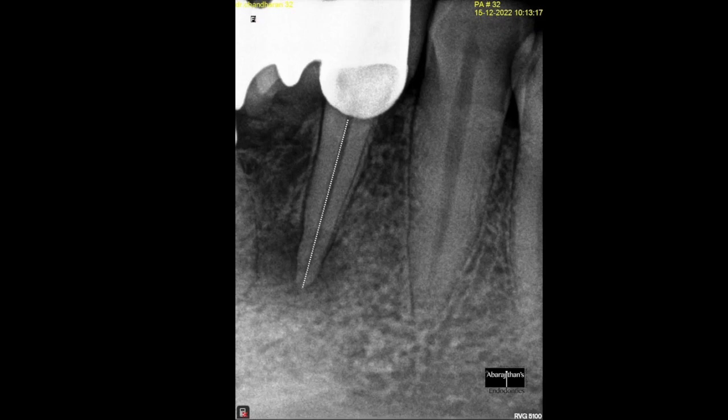These are the details that I could infer from my pre-op radiograph. I could see a pretty wide and continuous patent canal, so the chances of extra canals are almost ruled out from this pre-op radiograph. I also see a pretty big periapical lesion.